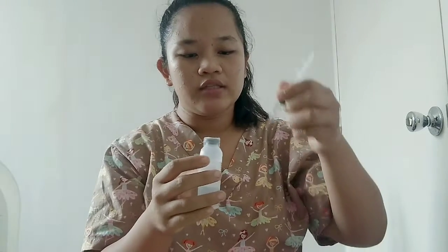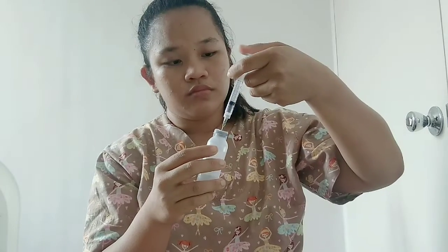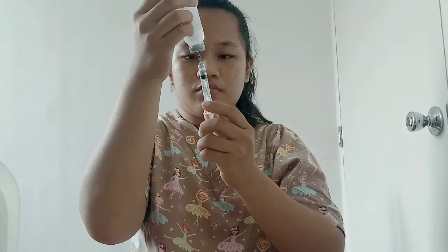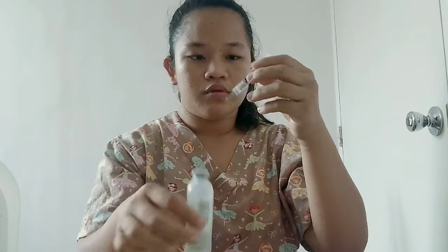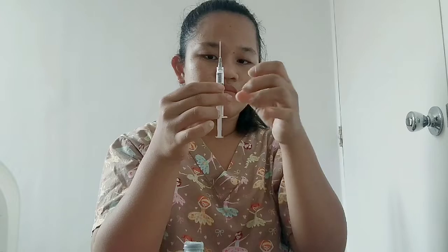And now we are going to inject the air into the vial. Then invert the vial. Let's make sure that we are only getting the exact amount of medication. If it has air, gently tap the syringe.